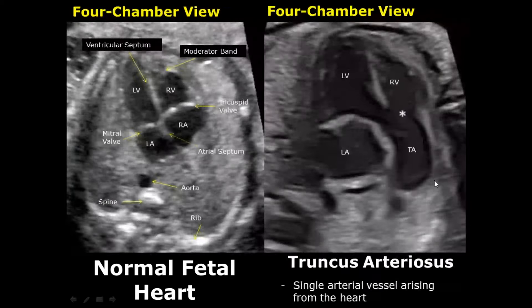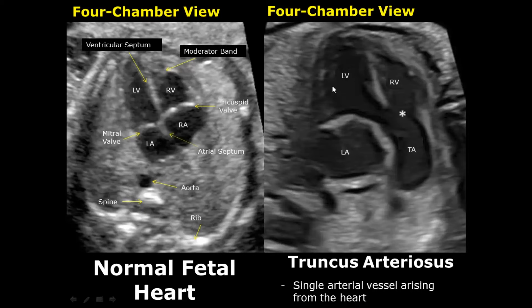In the case of truncus arteriosus, a single vessel will arise from the heart. Here we only see one vessel — we do not see a second vessel — just one vessel arising from the heart.